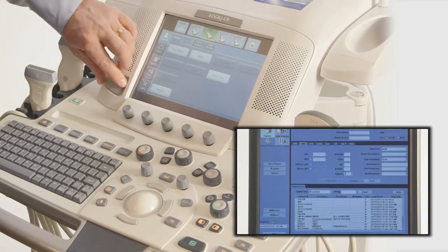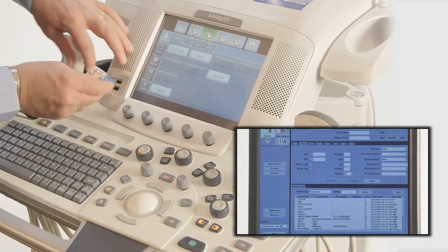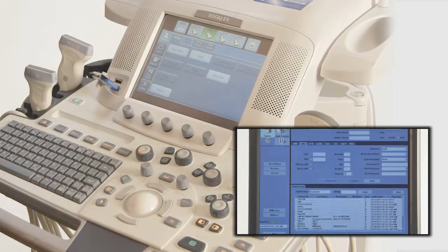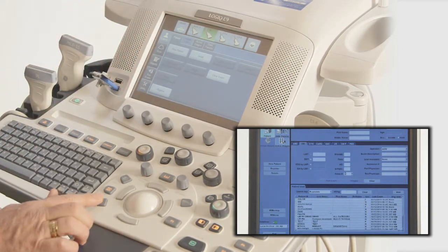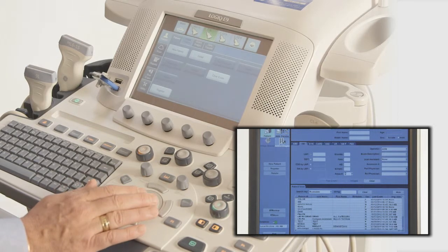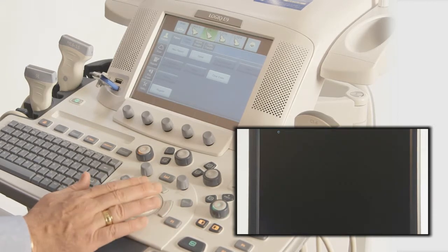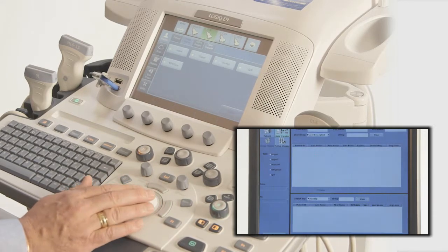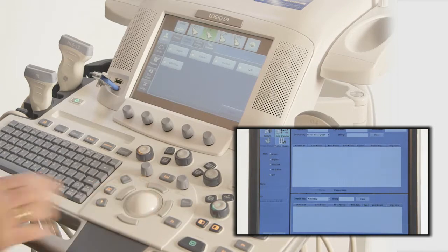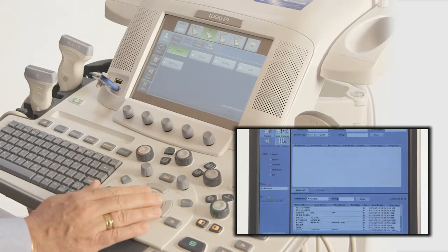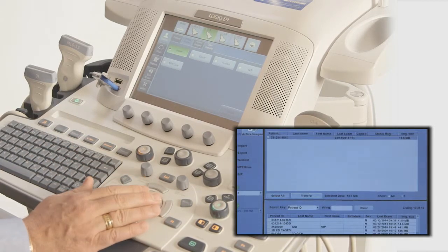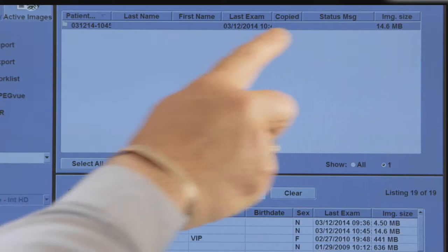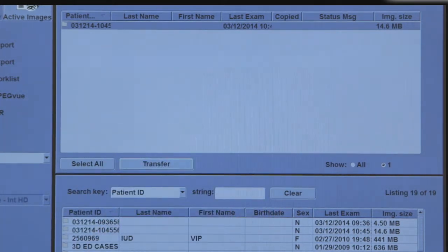reinsert the disk or USB, select Data Transfer, and then Import. The copied patient names should be on the top of the list.